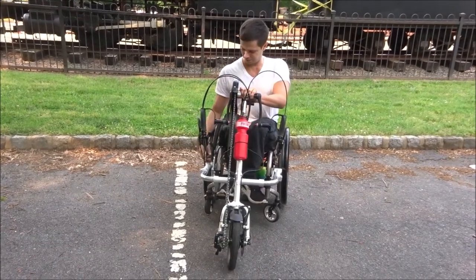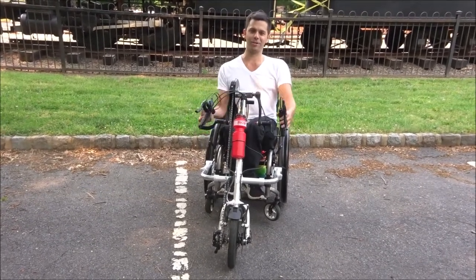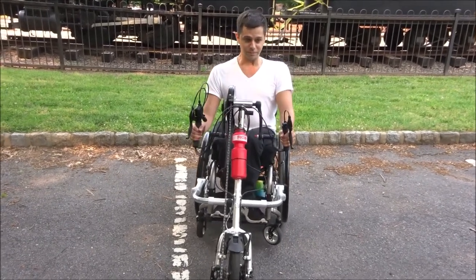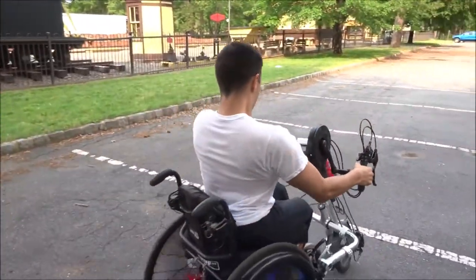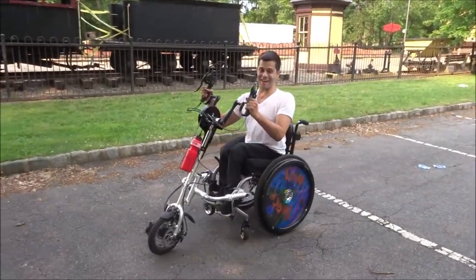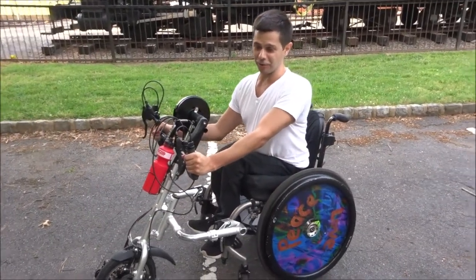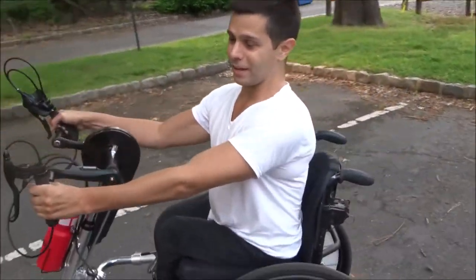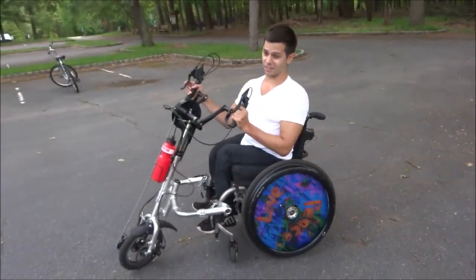Oh my gosh, I can't believe it. This is actually the first time that I've used this attachment since last fall — I'm recording this May 31st of 2019 — and I got it on the first try. That's amazing. It took me so long to do this the first couple of times last fall. I made it look not as difficult as it actually is, but if you noticed, I was actually still having quite a bit of trouble lifting it up, because it is heavy.